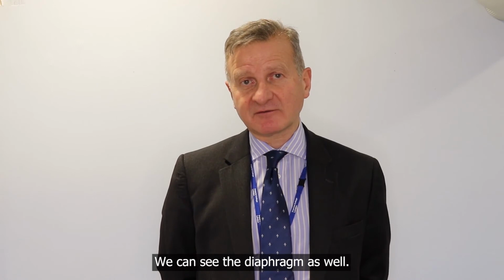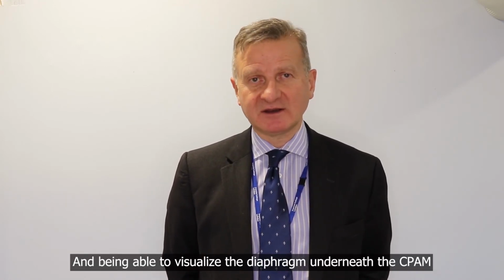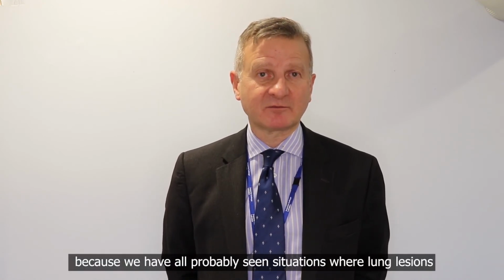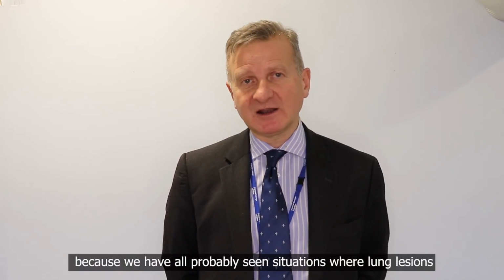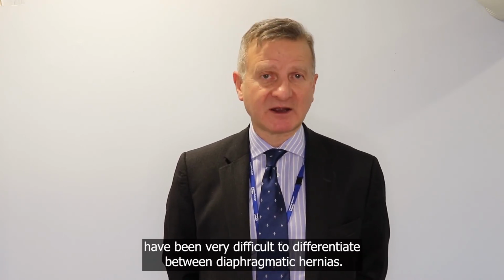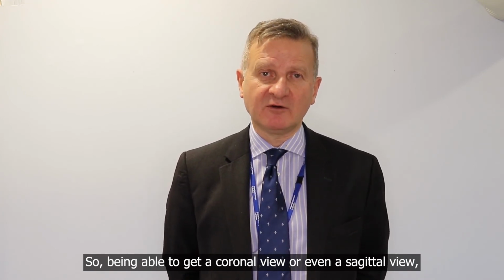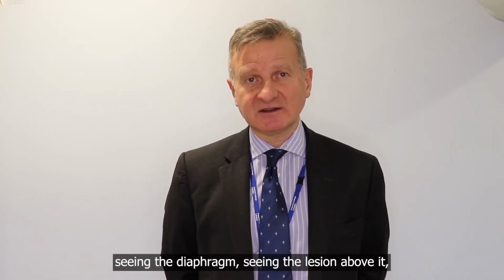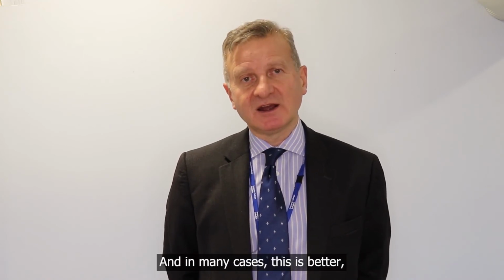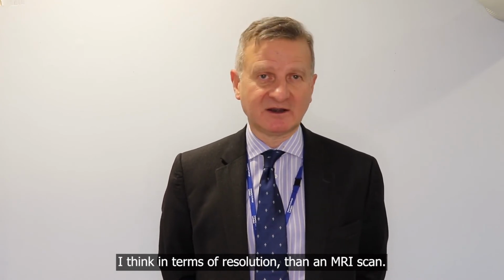We can see the diaphragm as well. And being able to visualize the diaphragm underneath the CPAM is really very important, because we've all probably seen situations where lung lesions have been very difficult to differentiate from diaphragmatic hernias. So being able to get a coronal view or even a sagittal view, seeing the diaphragm, seeing the lesion above it, is extremely reassuring. And in many cases this is better, I think, in terms of resolution than an MRI scan.